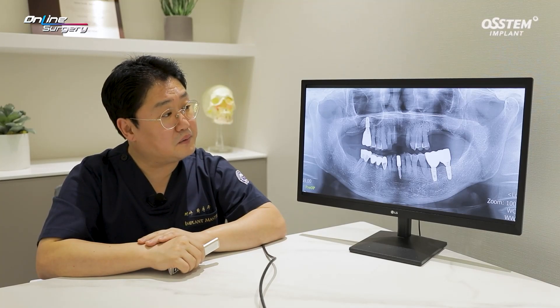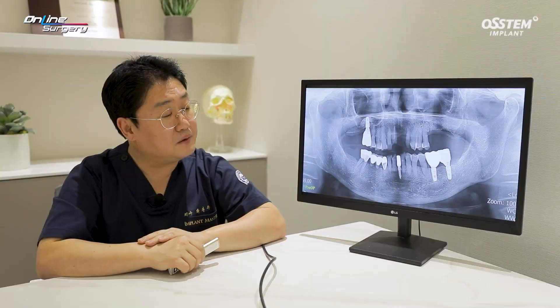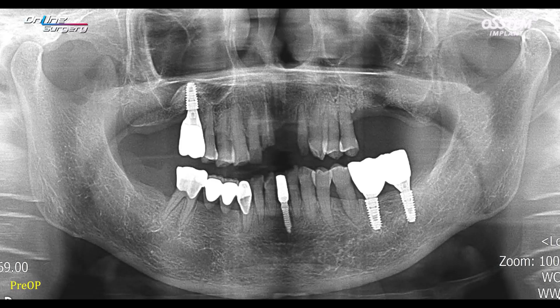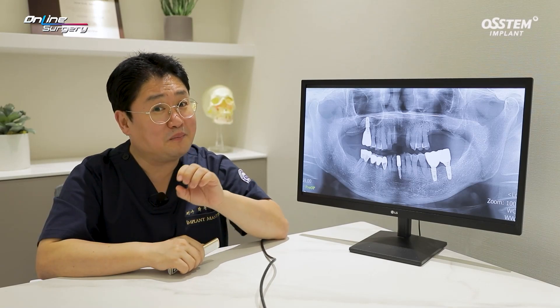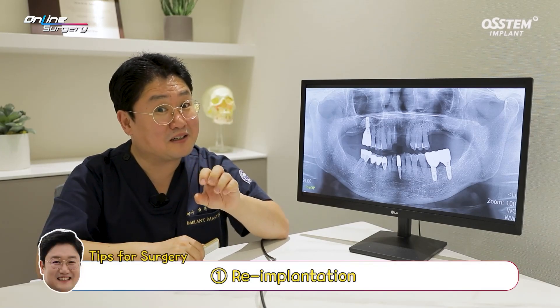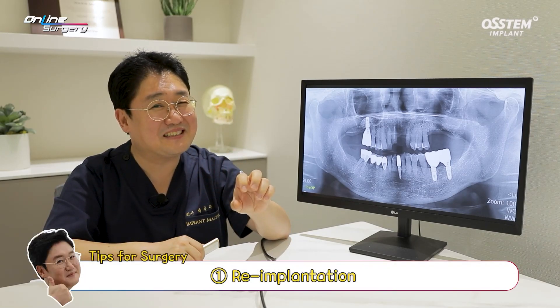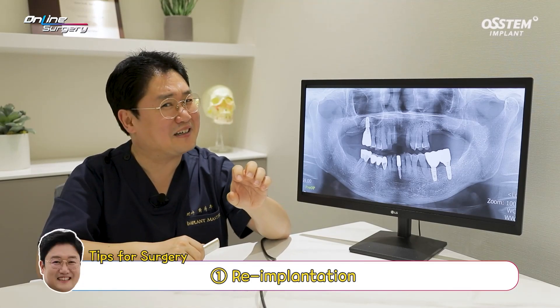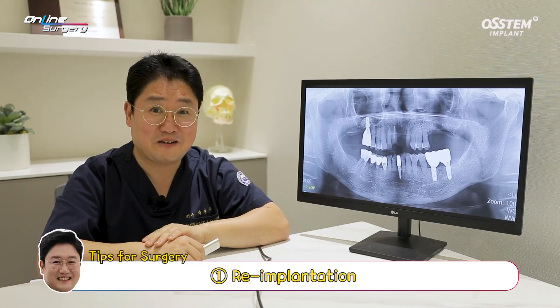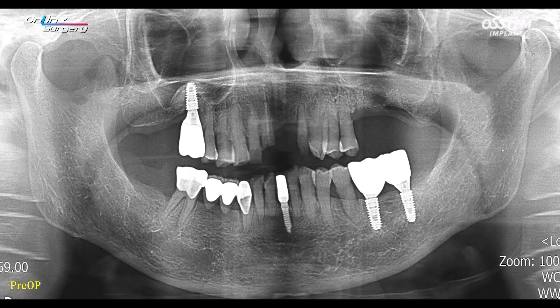After removal, the bone graft that was performed via the lateral approach was observed. In this case, utilizing this residual bone, the plan was made to place the implant once again. Guided surgery was planned.